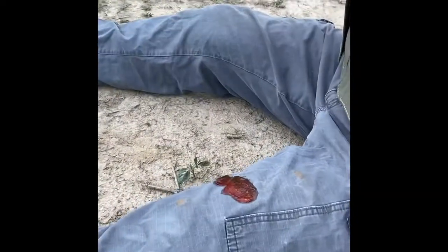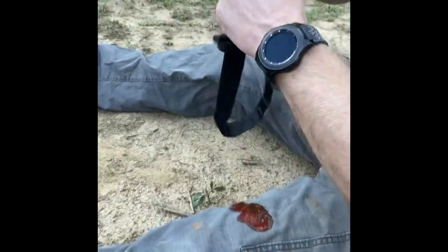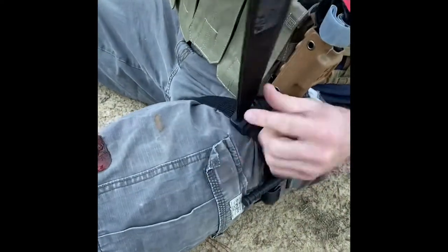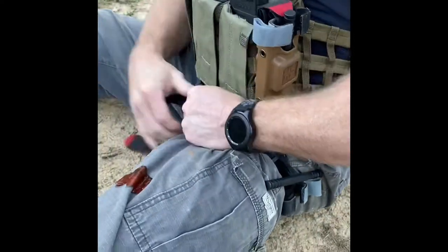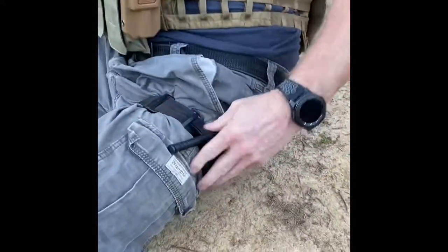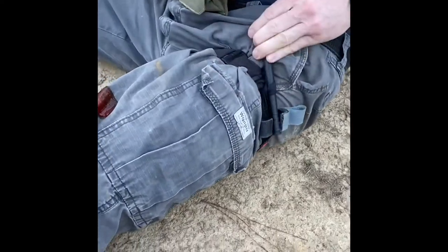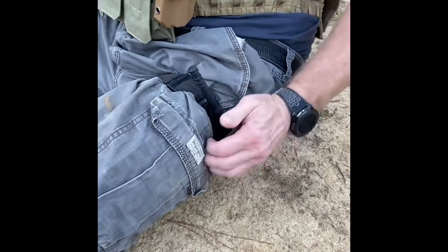I had a backup. I'm going to pull the loop as tight as I can, pulling it back toward myself. Watch the strap, and then we're just going to do however many turns it takes — two, three — for demonstration, just enough to cut the blood flow off and make the bleeding stop. Put that down and write your time. Two-handed is fairly easy to do.